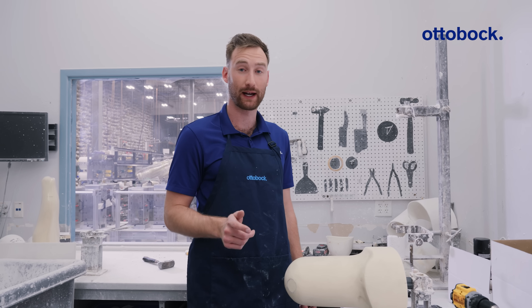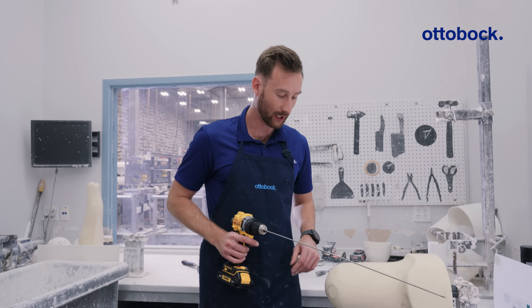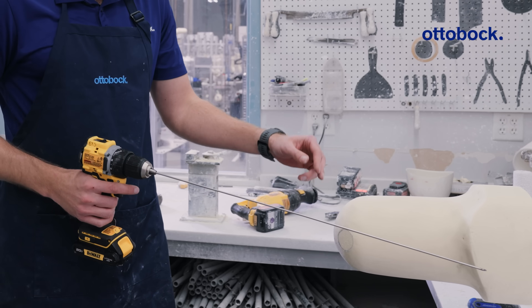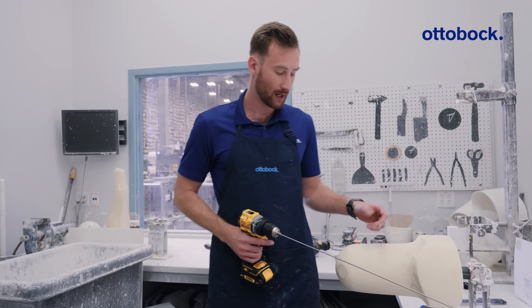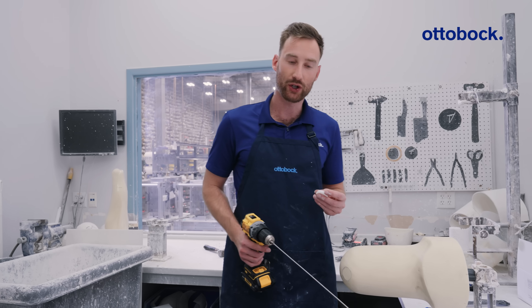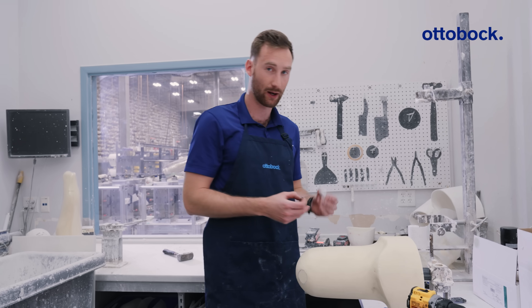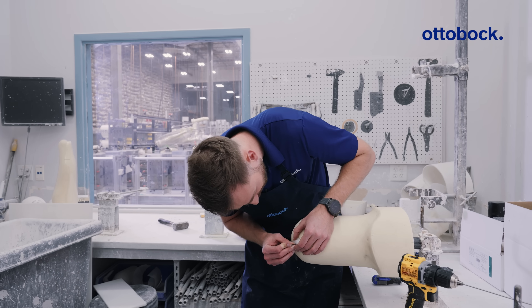This is one of my favorite tips. Our next step is we're going to take a long drill bit and drill a hole all the way from the bottom through the top. This is going to create a chamber for vacuum to pull around the dummy when we're making our test socket, to ensure there are no leaks on the valve. I'm going to mark the center point where the dummy will be attached with just a little mark.